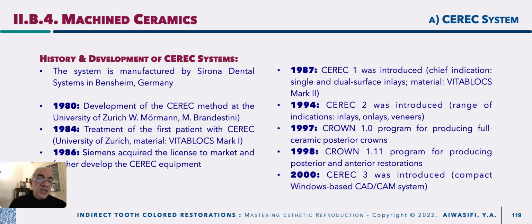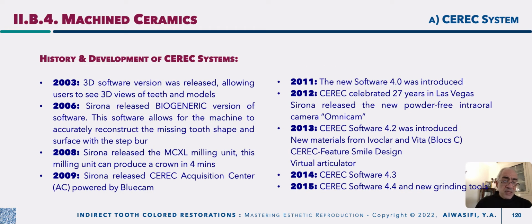You are not in need now to get a special CPU unit or a computer unit. Just you have your software set up on your Windows-based computer, okay, to design different restorations with CAD/CAM systems. Then in 2003, the 3D software version was released, allowing the user to see 3D views of the teeth and models, okay. In 2006, they released the biogeneric version of the software.